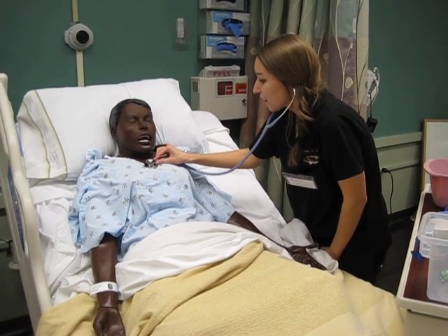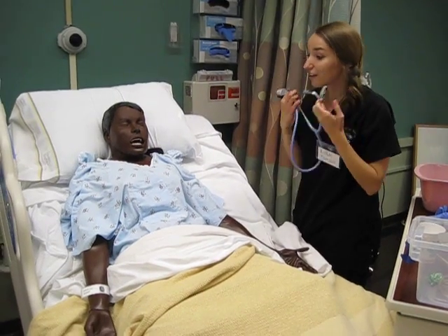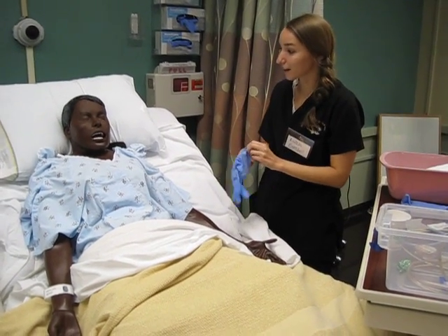That sounds good. Deep breath. Okay, everything sounds great, so I'm going to go ahead and start measuring the tube, and I'll sort of explain the process as we go.